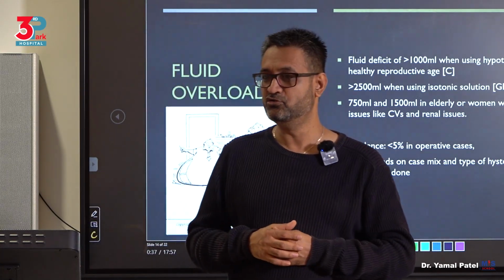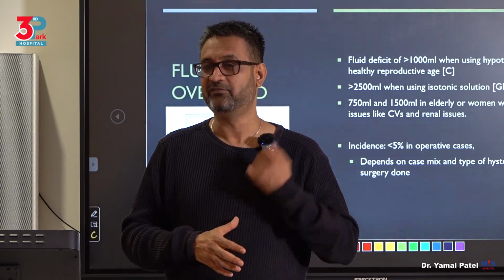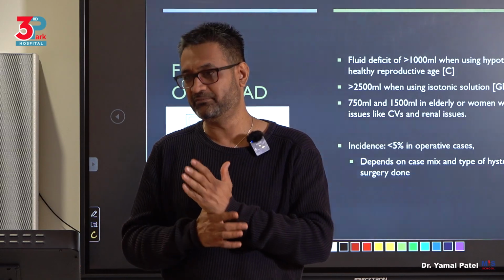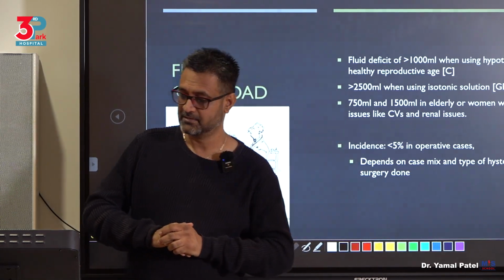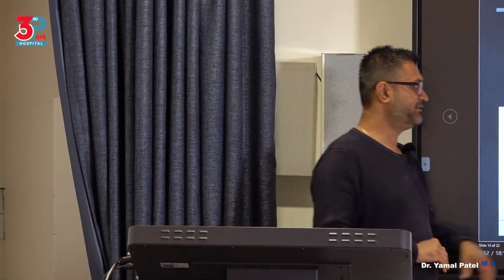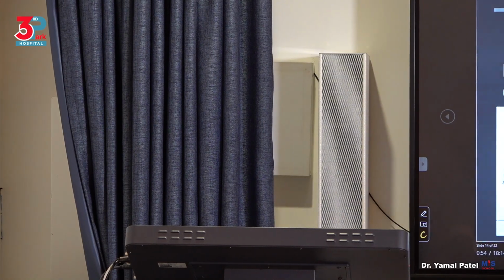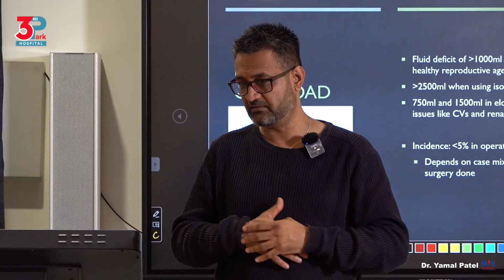Do not say, I have 5 more minutes to complete. My friend, you will land into problems. Okay? So know when to say stop. In saline, it's 2.5 liters, 2,500 ml. Stop the procedure. I mean it. Stop the procedure. Terminate the procedure.